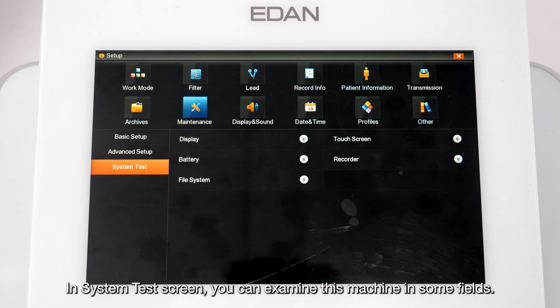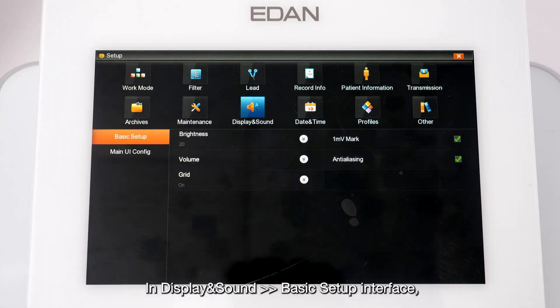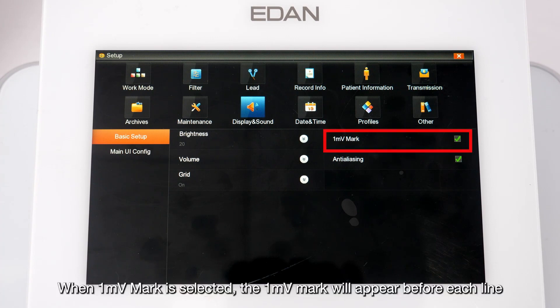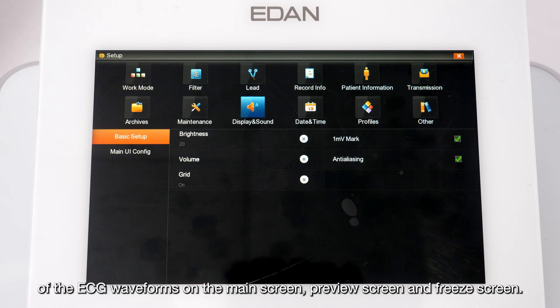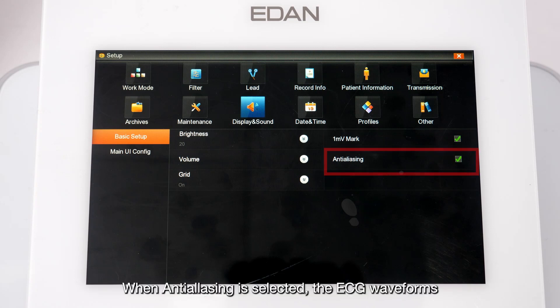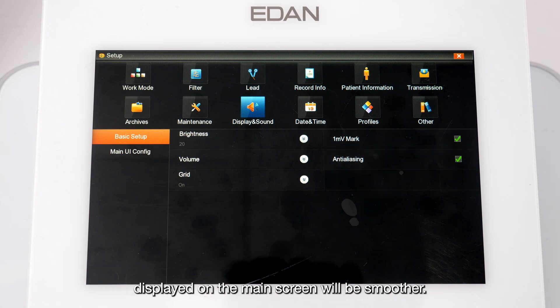In the System Test screen, you can examine the machine in several fields. In Display and Sound basic setup, you can change settings for brightness, volume, and grid. When Enable 1mV Mark is selected, the 1mV mark will appear before each line of ECG waveforms on the main screen, preview screen, and freeze screen. When Anti-aliasing is selected, ECG waveforms displayed on the main screen will appear smoother.